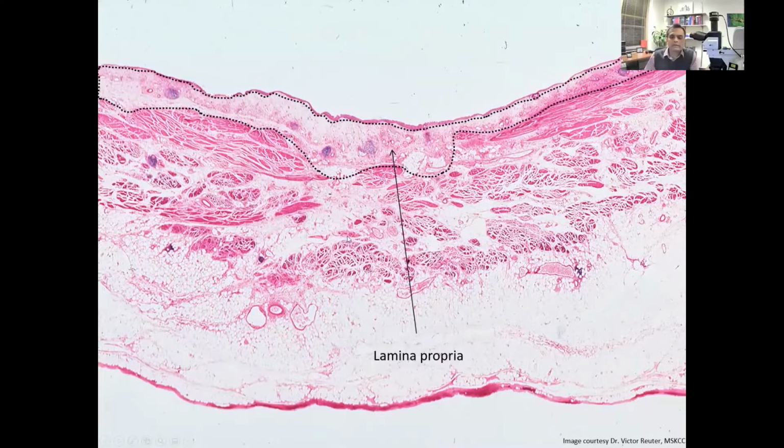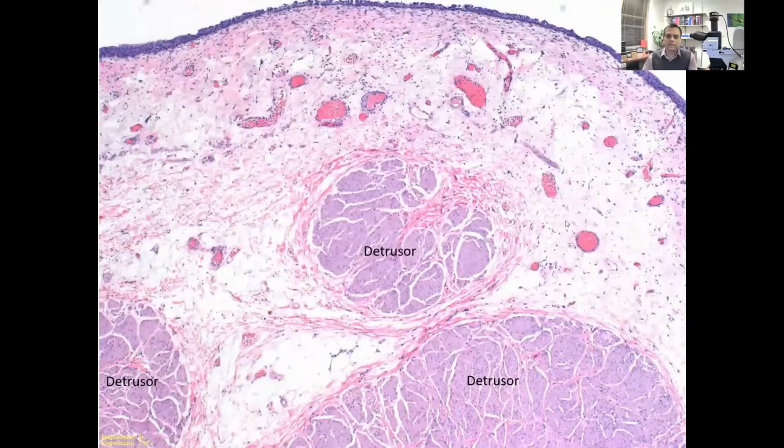So you can clearly see the variable thickness in the lamina propria here. So here's very thick and it's very thin, and there are several areas with intervening thickness. So it's a very ill-defined area. Not only that, some of the major anatomical landmarks that we use in the lamina propria, the most important one would be, of course, the muscularis mucosa, which we see over here.